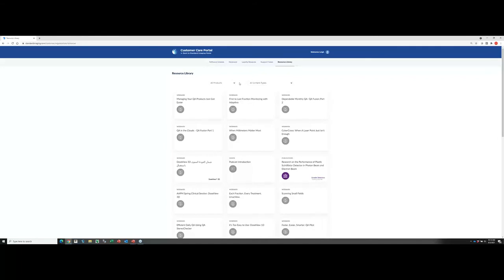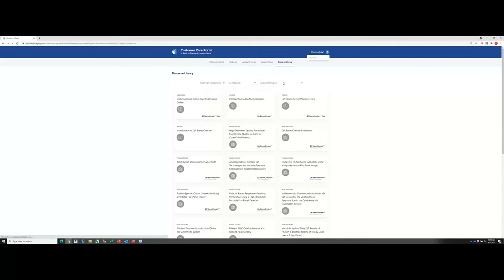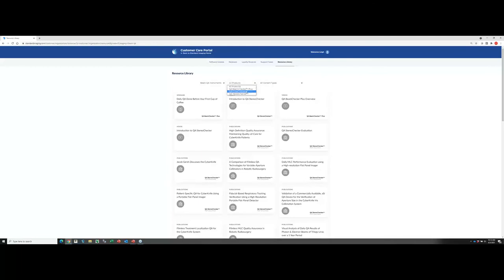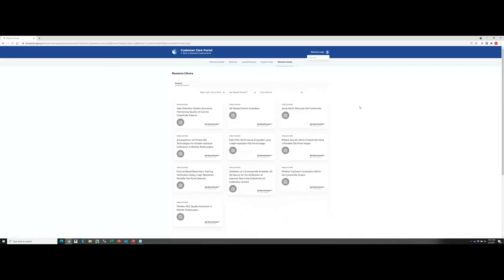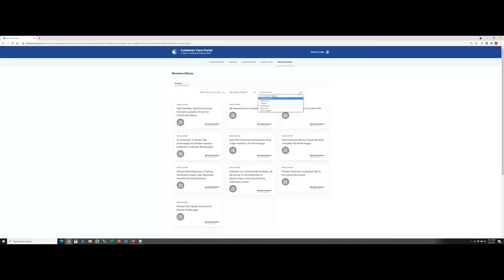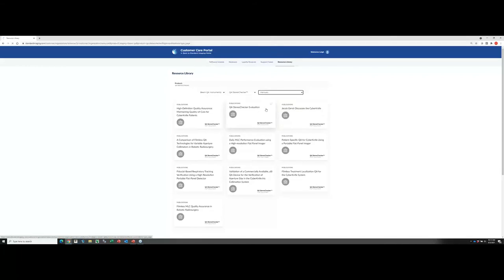Just as an example, let's say I wanted to find a manual for one of our QA products, our Beam QA products. You can see once I choose the Beam QA product, if there's additional options, I can then choose between our QA Beam Checker Plus, that's our daily device, our QA Cross Checker, which is our monthly device, or our QA Stereo Checker, which is primarily used for CyberKnife machines. As soon as I choose these different options, it automatically fails. In this case, I'm showing all the publications on our QA Stereo Checker, but if you wanted a manual, you could certainly go do that option.